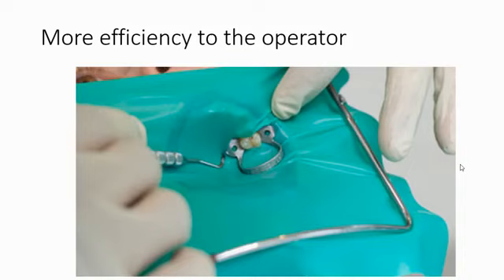Yeah, your working efficiency improves because now you are focusing on the tooth only rather than the other soft tissues which are always moving, like the tongue. So your focus is also sometimes deviated. तो जब आपका फोकस टूथ पे रहेगा जो कि अच्छे से आइसोलेटेड है, and you know, no contamination will be there and no soft tissue will interact, all the cheeks will be retracted, so it will be very easy and it will be very efficient.